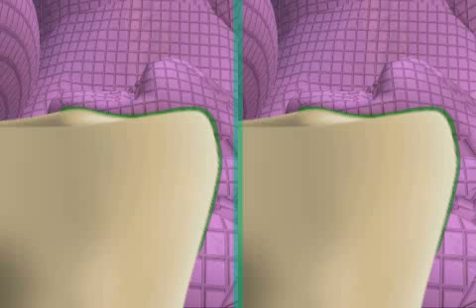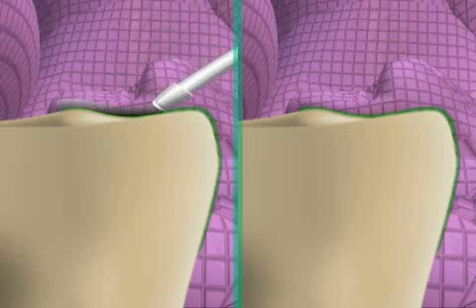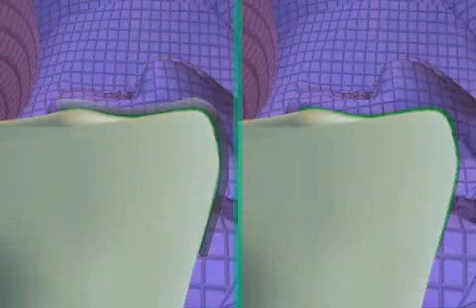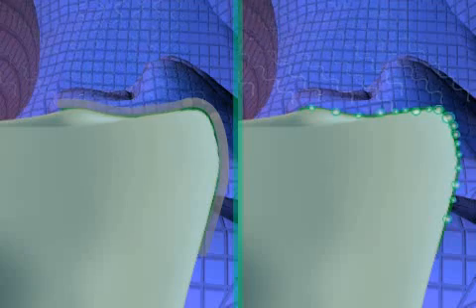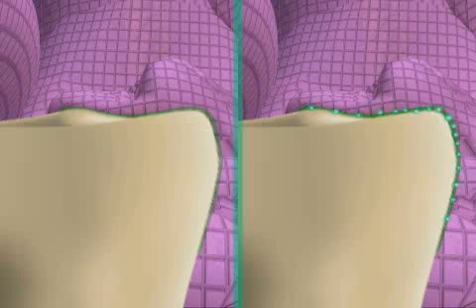Now Air Block is applied on the left side but not on the right. This isolates the glue gap on the left but not on the right. On the right, there is renewed bubble formation because the glue does not harden as well when exposed to air. Through the use of Air Block, the left side hardens much better, creating a smooth glue gap.